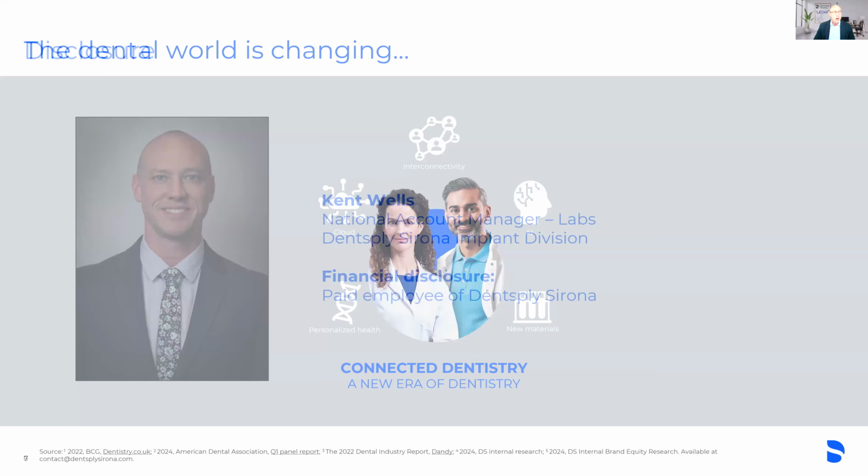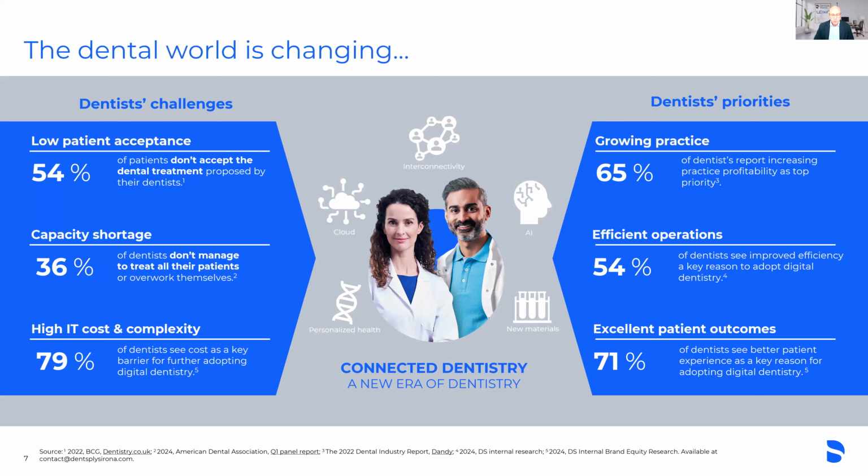So let's start with where we're at in the dental world. Everyone's familiar with digital dentistry. And what's been happening with digital dentistry has been a rapid adoption of multiple different technologies coming together into one clinical setting. And it can sometimes get a little messy. So how does the interconnectivity work between different technologies? And what we're finding is even though we have this adoption of digital technology, we still have a relatively low patient acceptance rate. So only 54% of patients don't accept their dental treatment. So there's a lot of opportunity. And how do we improve that through the technology and through connected dentistry?